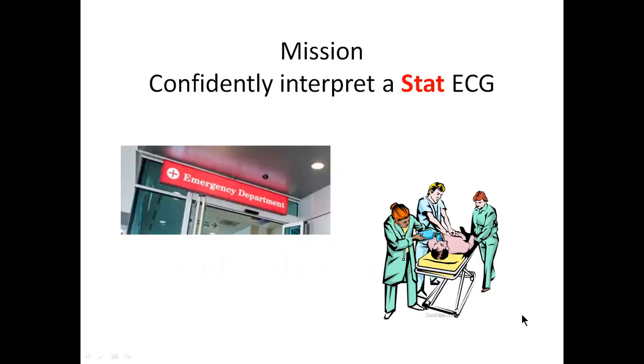So, my goal is to teach you how to confidently interpret a stat ECG soon after you graduate from med school.